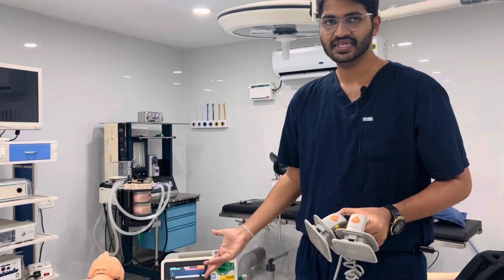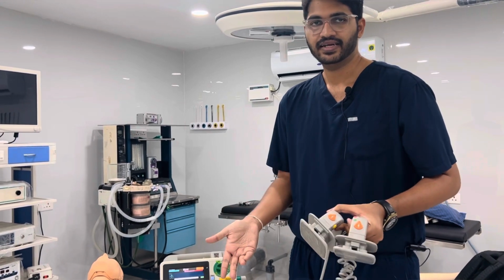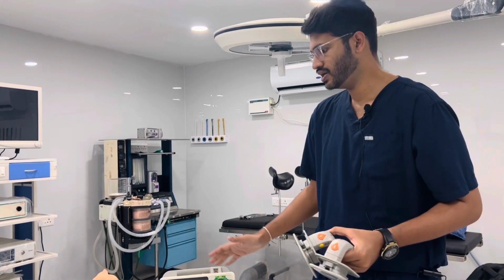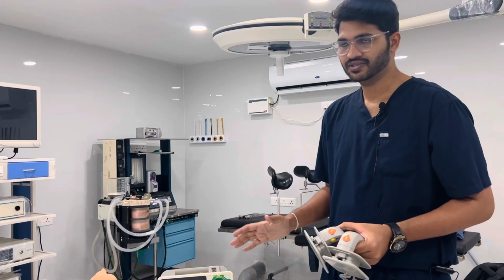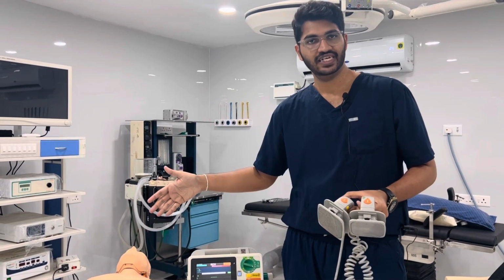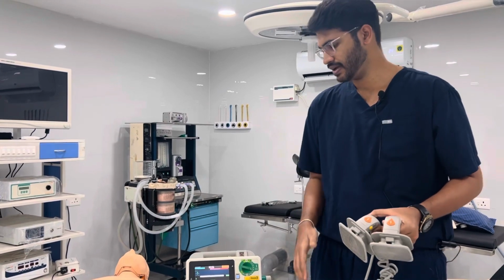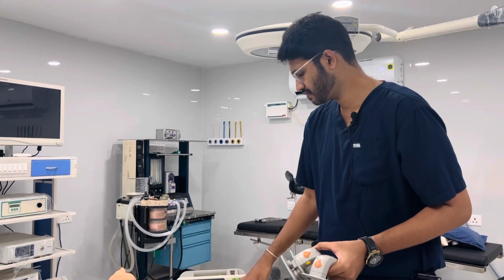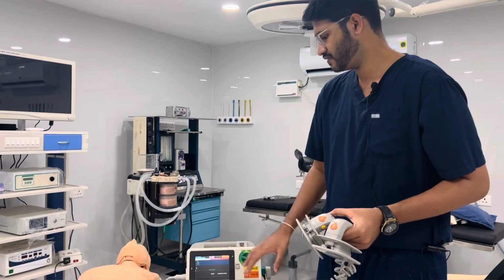If you don't press the sync button, it's like directly giving the shock in the refractory phase, so the patient might collapse. So you should carefully notice whether the patient has a pulse, whether it is pulseless VT or VT with pulse. And as per ACLS, we have to follow other drugs and protocols. So these are the basic setups of a defibrillator.